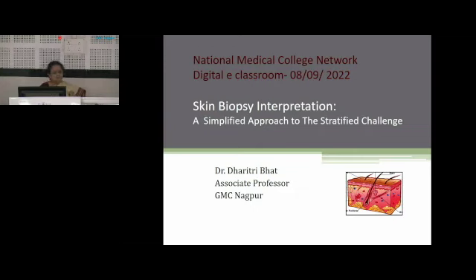Today's topic is skin biopsy interpretation and a few psoriasiform and vesiculobullous lesions. I shall be speaking on skin biopsy interpretation, a simplified approach to the stratified challenge. I say that this challenge is stratified because at every level, starting from clinical, technical and interpretational, there is a challenge.